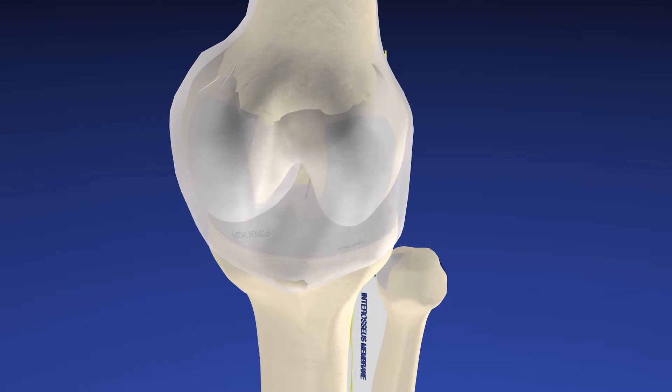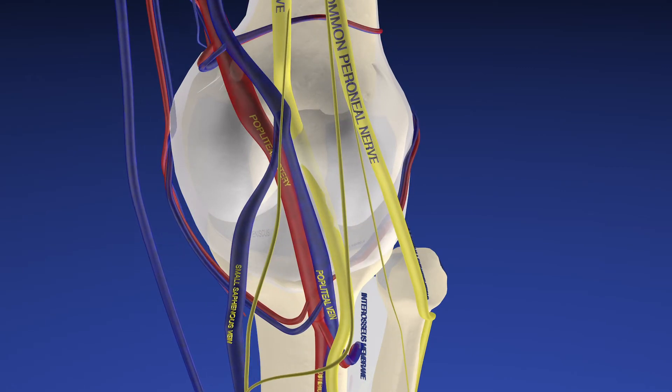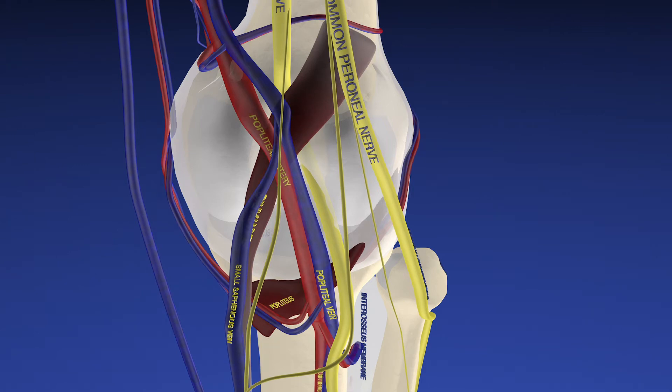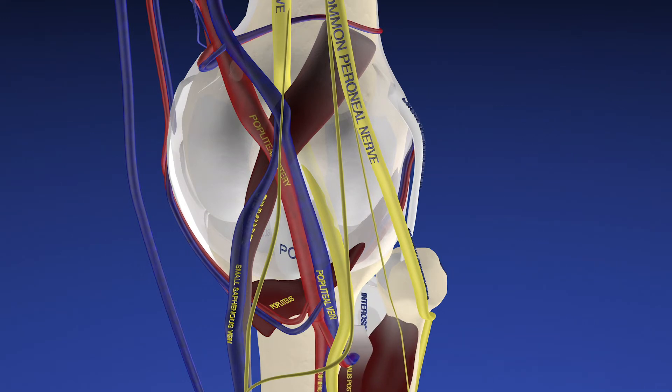Here we can see the capsule overlying the knee joint. Now we're bringing the neurovascular structures into view, followed by the deep muscles such as the popliteus and plantaris muscles. Here are some of the ligaments around the knee, and now we're bringing the lateral compartment into view.